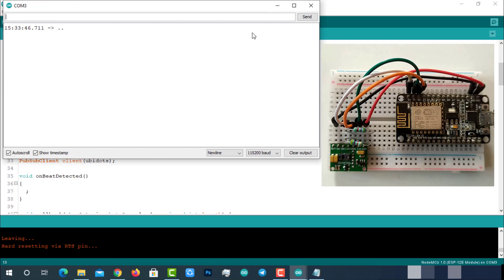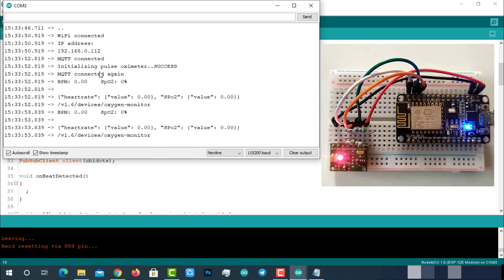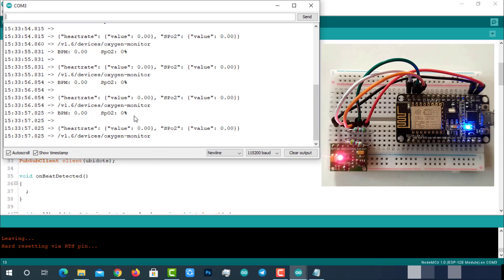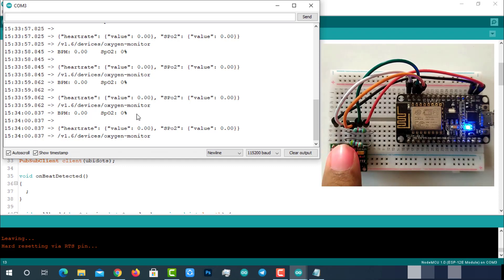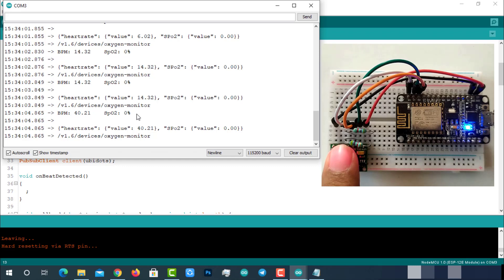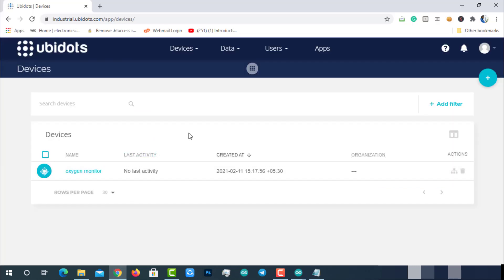On the serial monitor, we can see our ESP8266 successfully connected to the programmed Wi-Fi and allocated with an IP address. Then it initiated MQTT connection with Ubidots cloud and connected to it. Then it started publishing heart rate and percentage of oxygen saturation, which is SpO2 data, to the Ubidots platform. Gently place your finger on the oximeter and you can see the live data on the serial monitor. Do not press your finger hard - that will lead to inaccurate data.